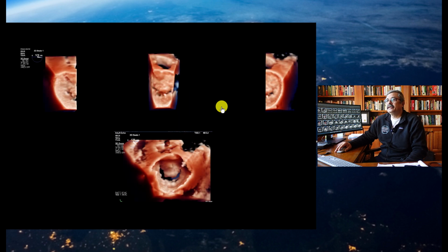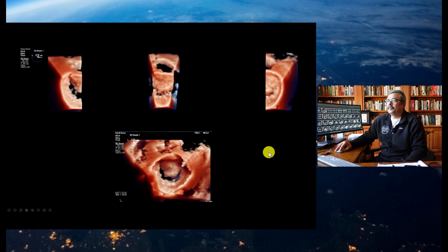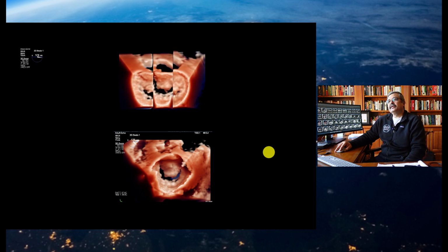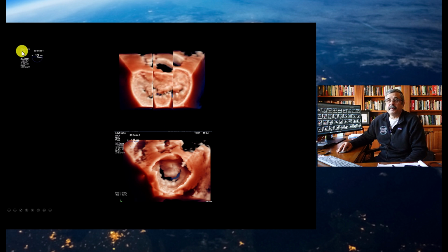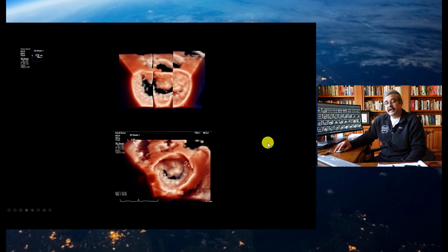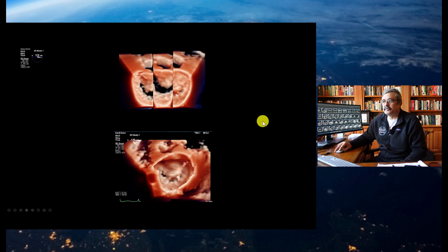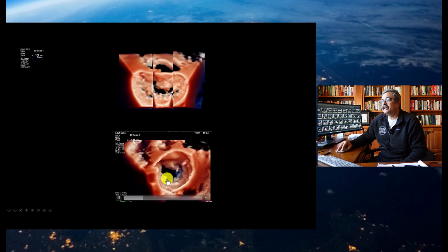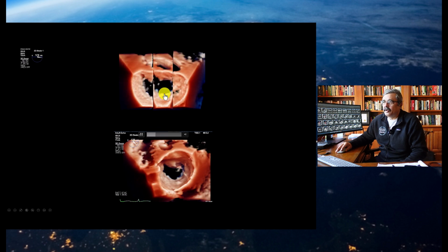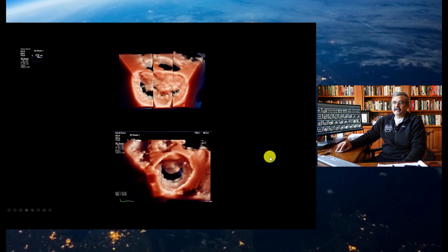So now if you put it all together, this is the front elevation, central elevation, and this is the back elevation. Putting them together is a mental reconstruction, bringing all three together to make a three-dimensional model of the mitral valve at a frame rate of about 38 hertz for each of them, as opposed to the 10 hertz we achieved with the wide-angle live mode. And we have even eliminated this little artifact on the anterior leaflet because of improved line density. While over here you cannot appreciate this flail segment as well, clearly you can see in the central elevation that there's more flail involved in the A2, P2 as well as the A1, P1 side, and therefore we deployed the clip on this side of the valve.